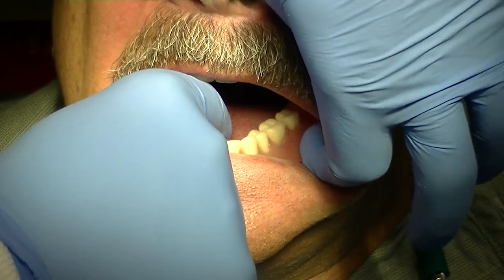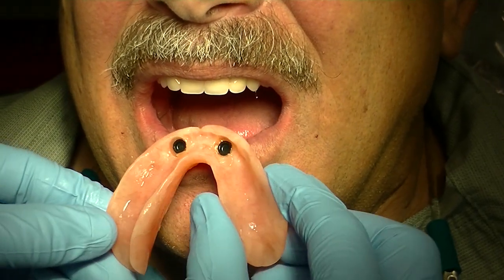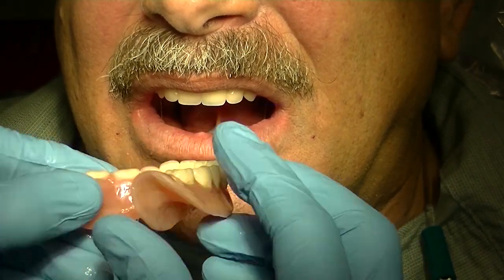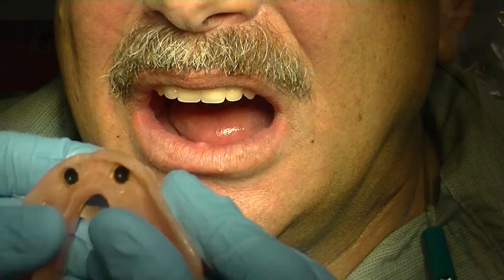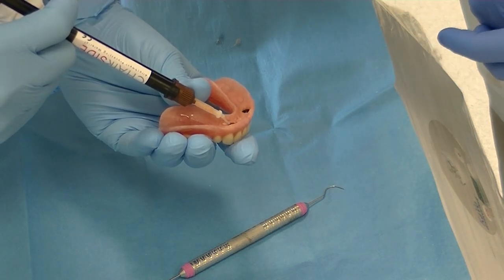This is what I also teach my patients. Initially it might be stuck in there pretty well. As we remove it from the patient's mouth, it'll kind of give a sense that everything's starting to feel pretty good. As we look at the attachments and how the denture caps have been picked up, we have a pretty good flow. A little bit of excess has come out the lingual and minimal resin flash on the intaglio surface. We do have a couple of voids that we can fill in.